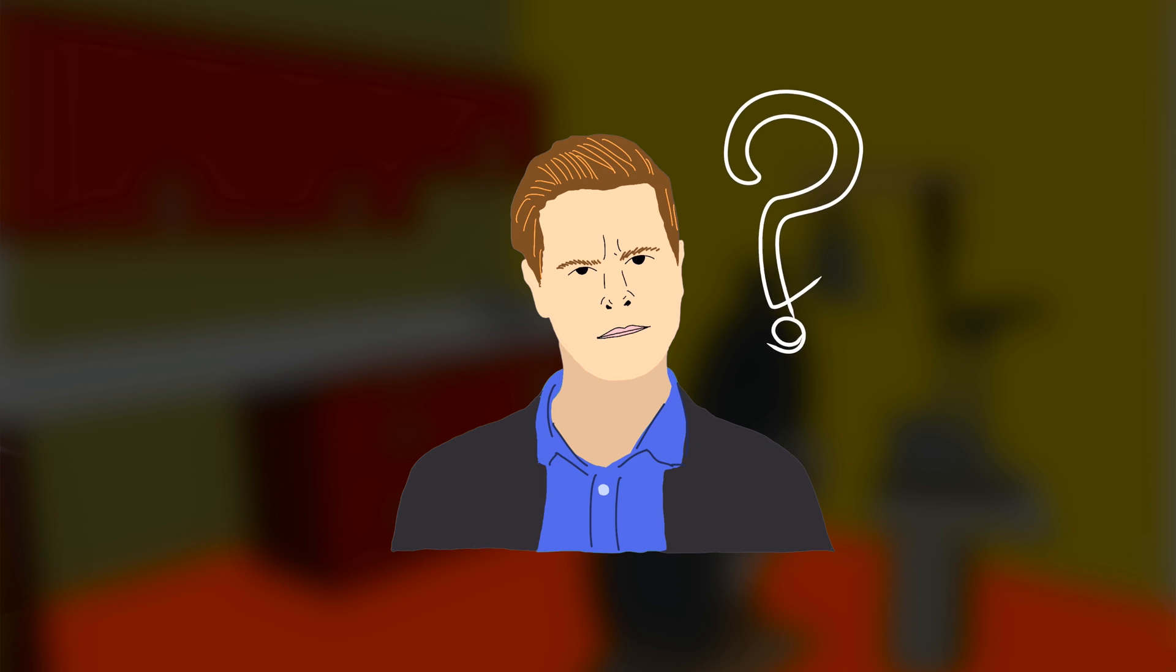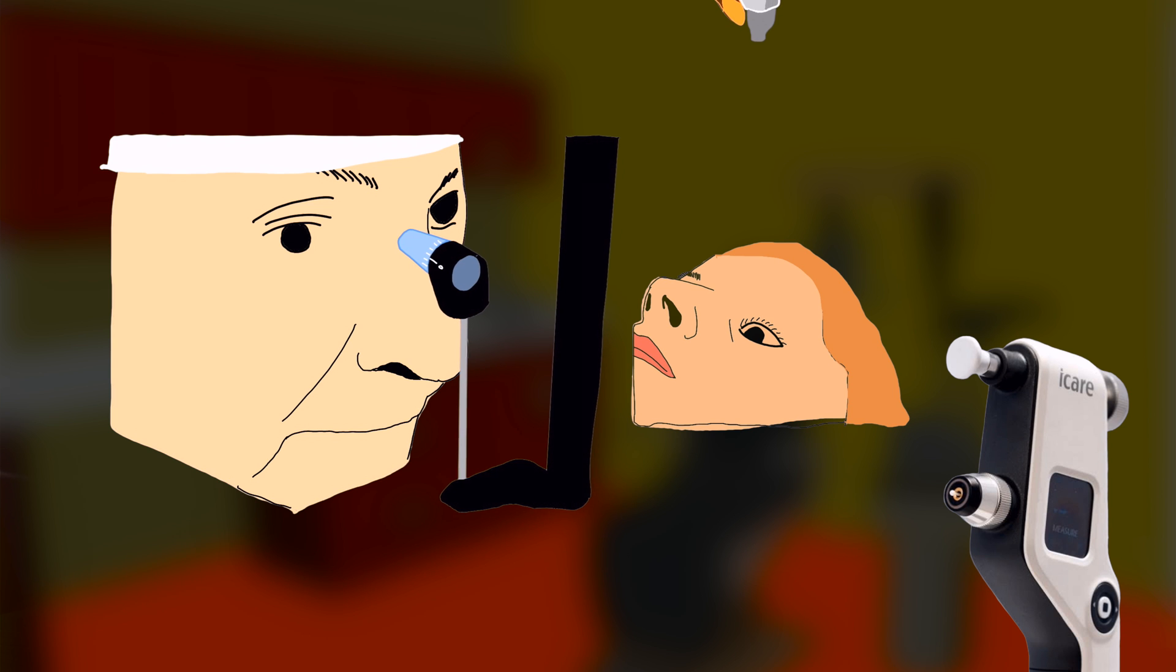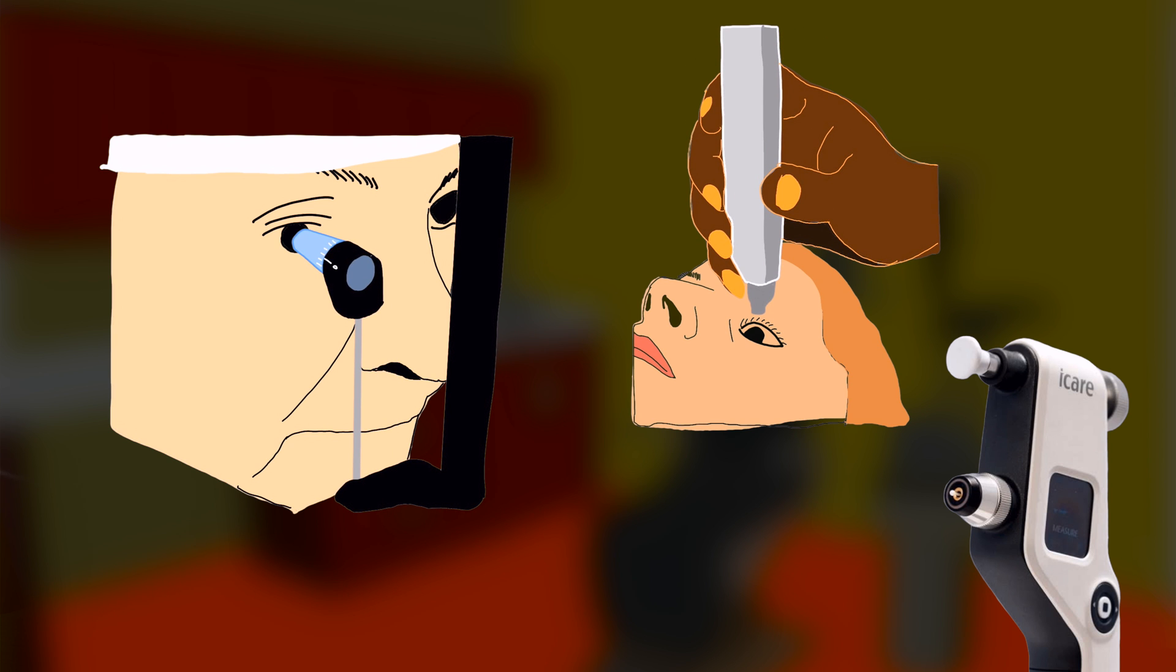But Antonio, I went for an eye test the other day, but they didn't do this puff test. Don't get me wrong, there are multiple ways you can measure pressure, and your optometrist may have just used a different method. But they all work off of the same principle, how much effort is required to flatten the cornea.